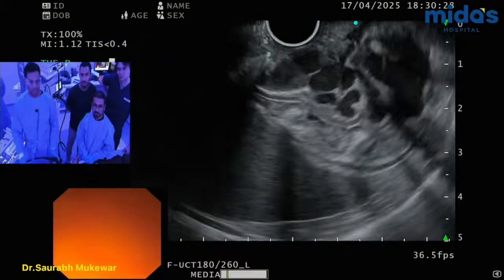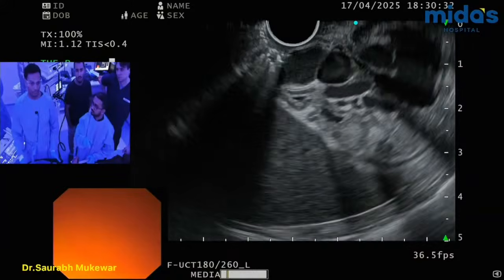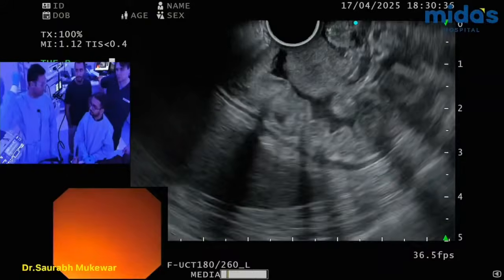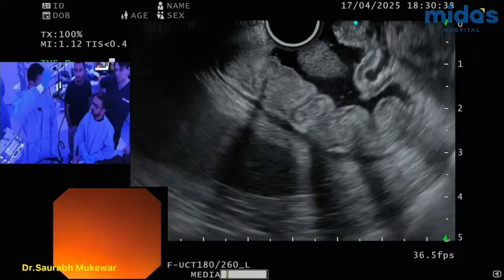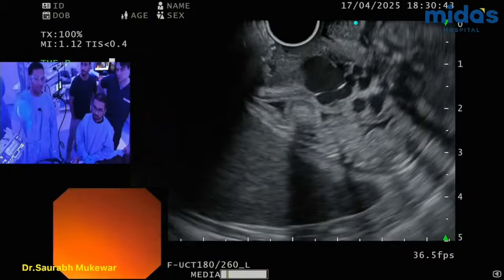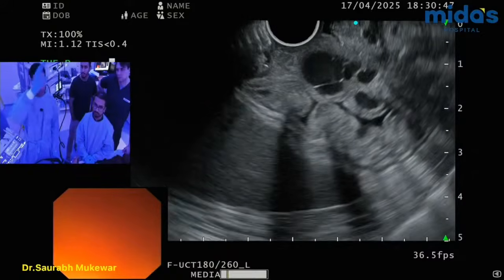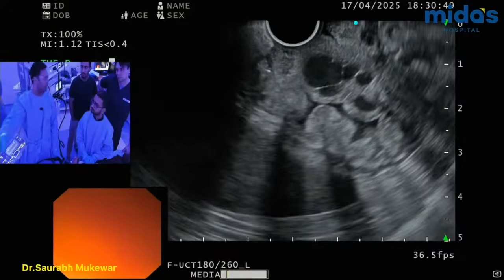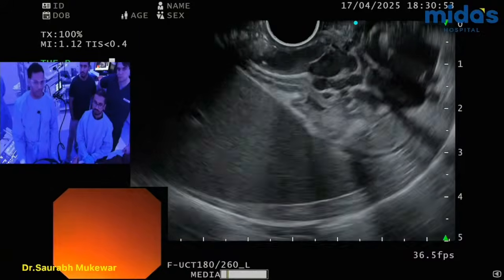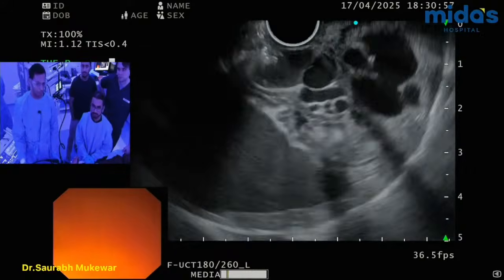Risk of embolization is more if you target it somewhere around here. When you target somewhere here, it's going to go out, it's going to embolize. Why did it inflow? So the inflow, it went in, and it has not reached the outflow at all. So I know 101% sure there's no embolization happening here. Why? Because I did the inflow, the glue is only in the varix, it has not gone out, and I saw 2 cc would do fine, and it's fine. And most likely I don't even have to do anything about this, because you should not bleed from there, technically.